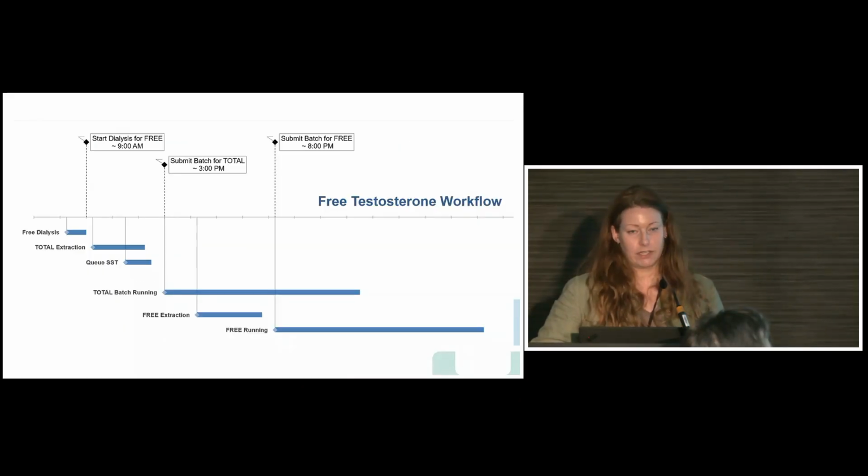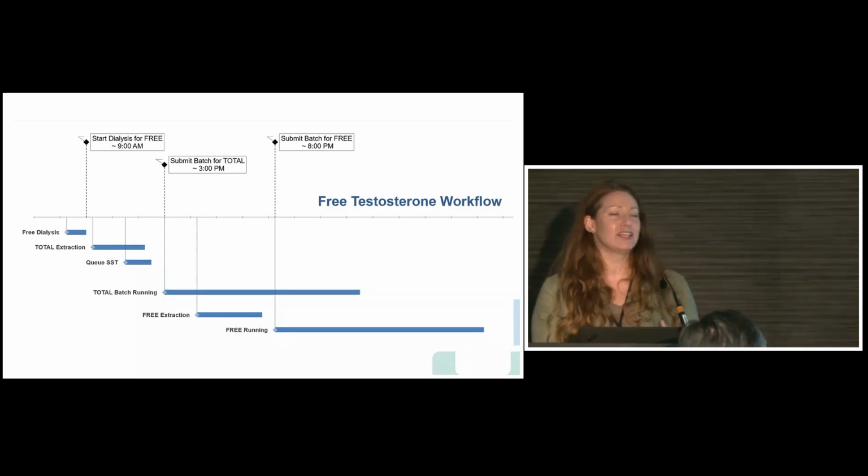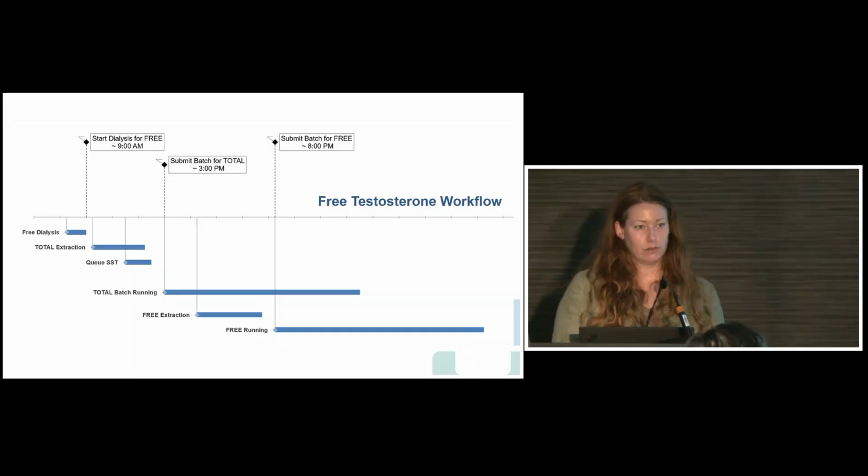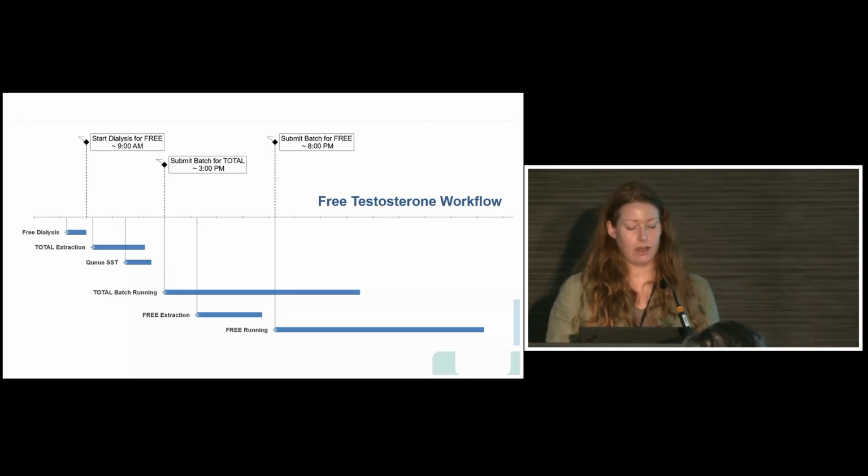I'd like to also present an example of our workflow. So method development is not linear at all. I'm sure everyone here knows that. So you really need to think about how your assay is going to impact the lab. Like, is it doable? Are we going to stress people out?